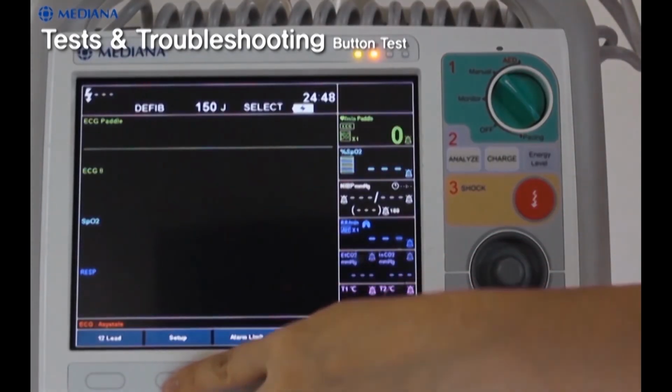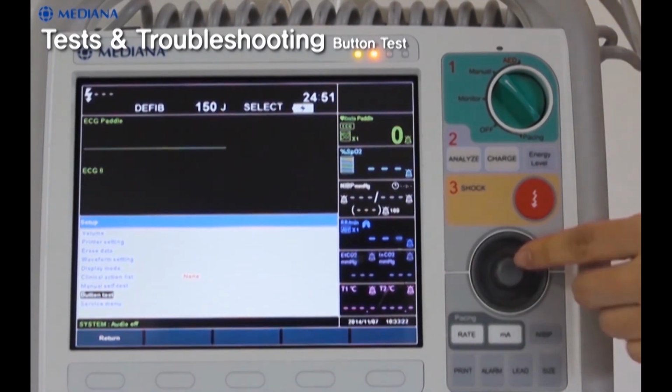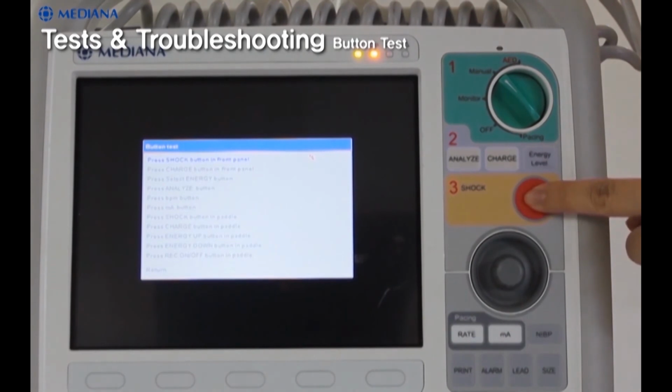By pressing the respective buttons, you see whether each button is functioning properly. The button test can be divided into 2 types, front panel and paddles.